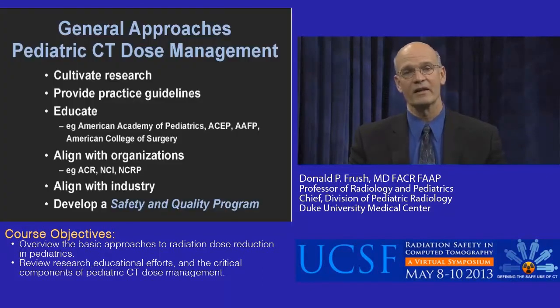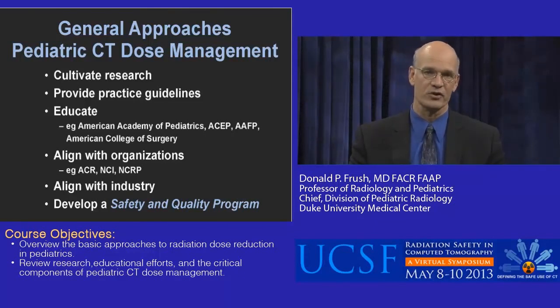And we consider our CT protocols relatively low dose to begin with. And finally, there are other general approaches to CT dose management. I did not touch on all the technical aspects there, but just a few. But these are some other ways that we all collectively need to improve our scanning for children in terms of that balance between dose and image quality.